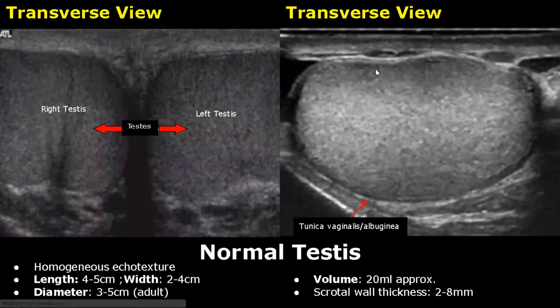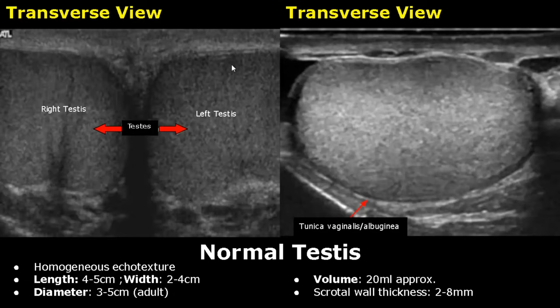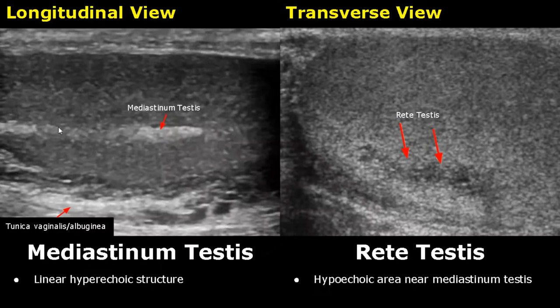In this transverse view we can see both the testes — here is the right testes and here is the left testes. The mediastinum testis is seen as a linear hyperechoic structure in the testes. The rete testis is not easily visualized but appears hypoechoic and is located near the mediastinum testis.